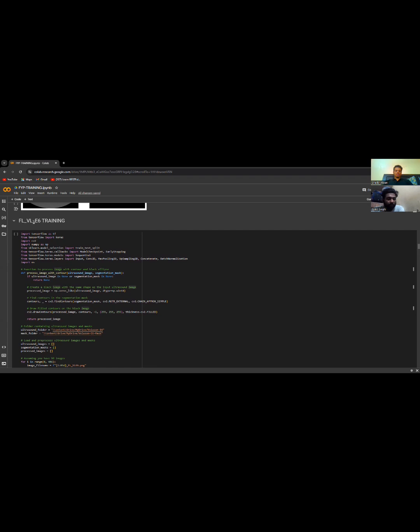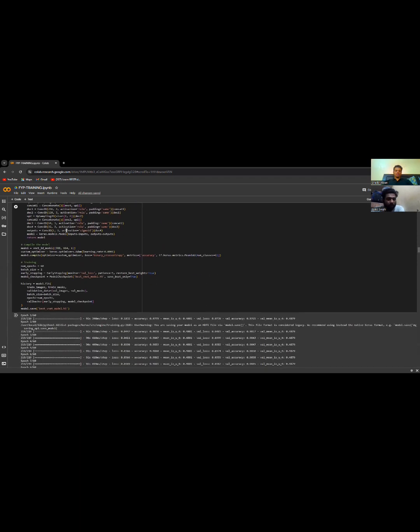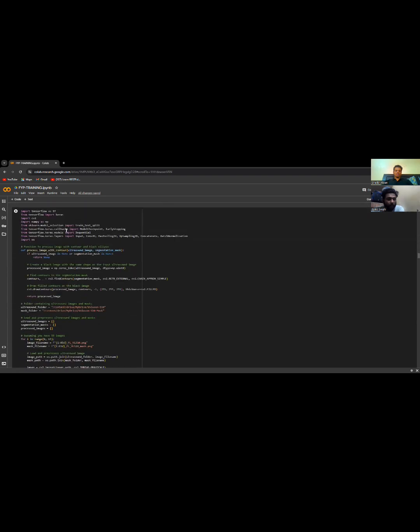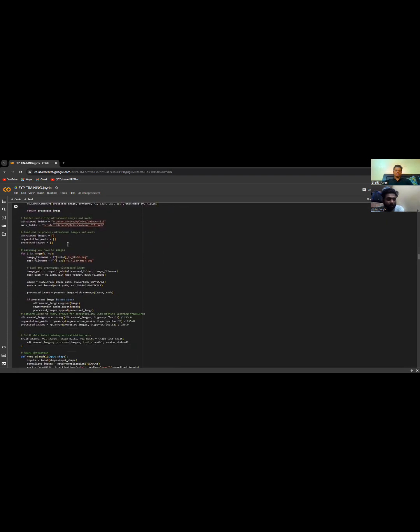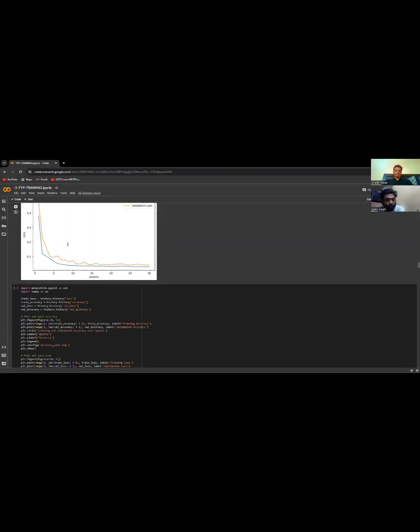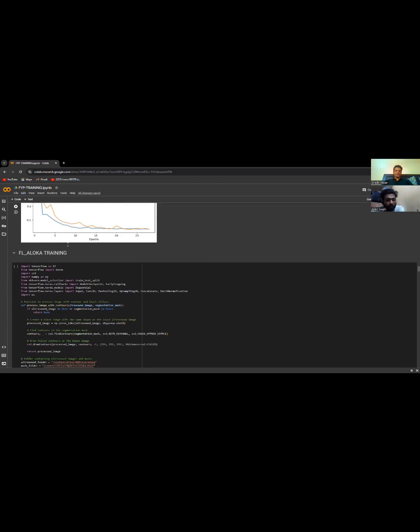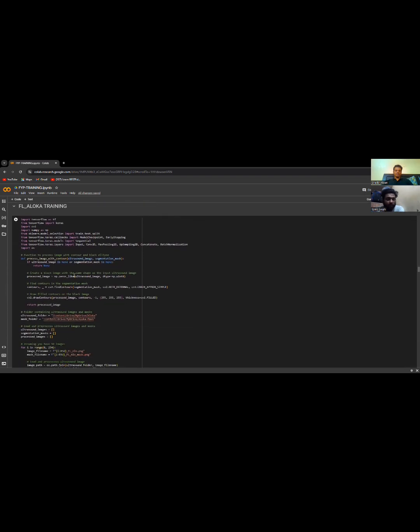Now we have four different machines for femur length. We have the Voluson E6 as one, then the S10 machine, then Aloka machine. We trained all these images.